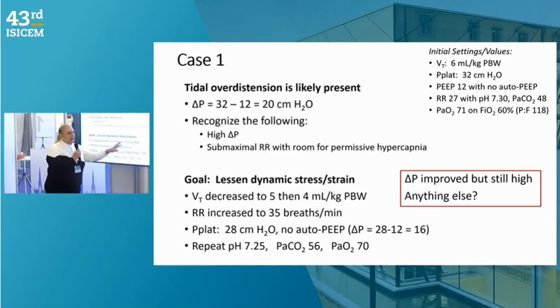When you reduce the tidal volume, you reduce the amount of mechanical power in the baby lung, because you are starting ventilating this baby lung. But he has to do something, because he needs to focus on the pH. So he decided to increase the respiratory rate, even though respiratory rate may increase the mechanical power and induce more damage. We know that the first parameter to be modified is the tidal volume.